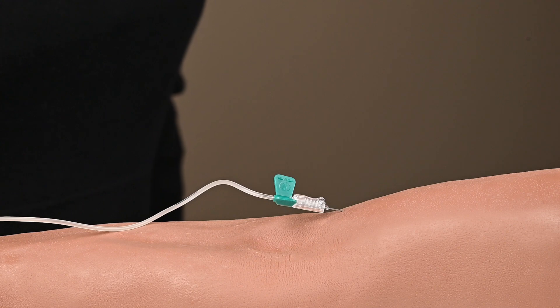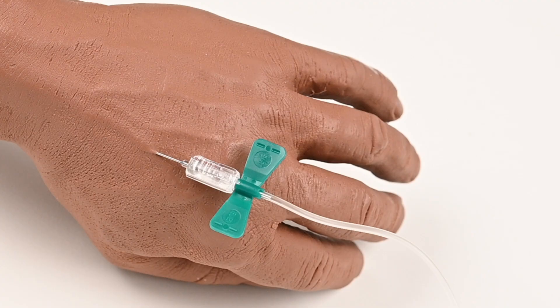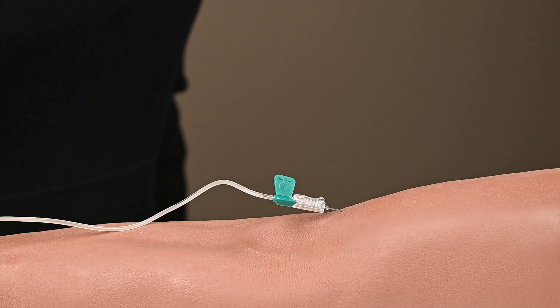The modified two-hand technique is used when the needle depth is shallow, the needle is placed at a 45-degree angle, or the draw is performed on the hand. These situations will not allow the device to lie flat.